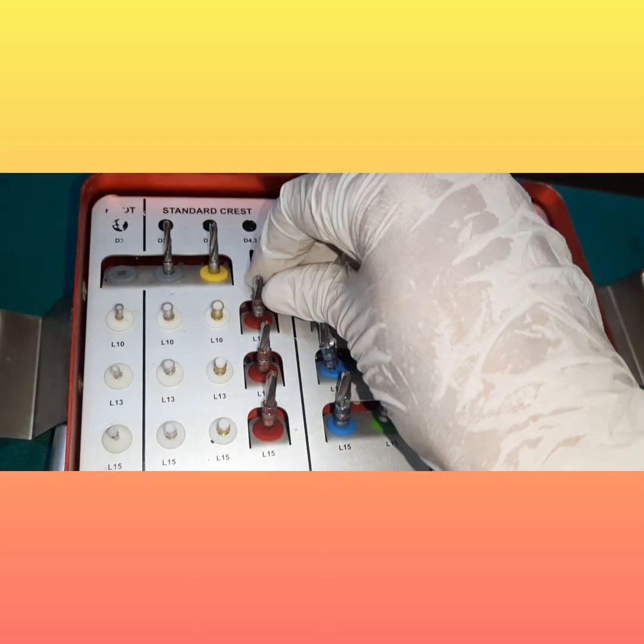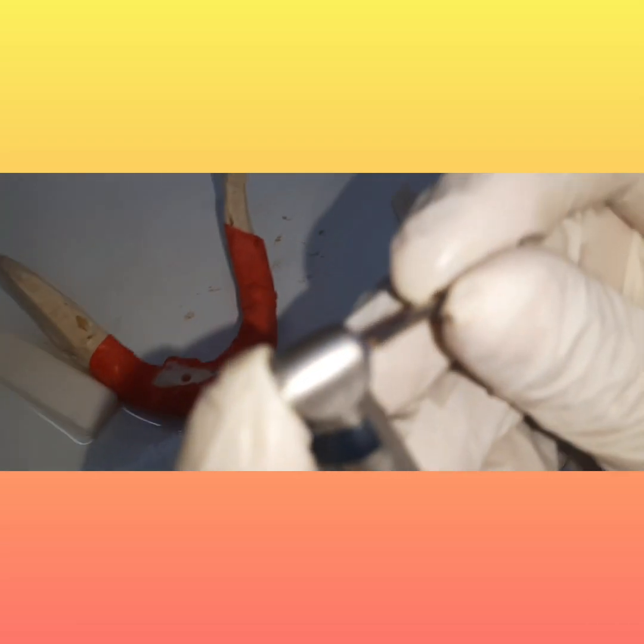Can you see how smoothly you have the placement side, the osteotomy side? Next we'll take up the diameter 4.3. Again, do it sequentially.